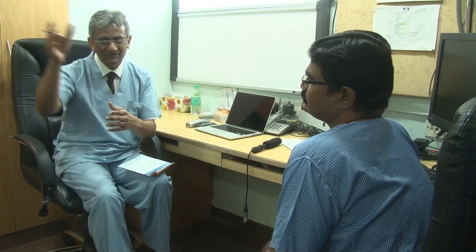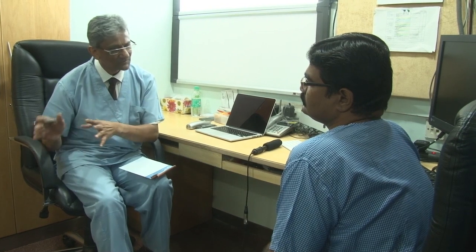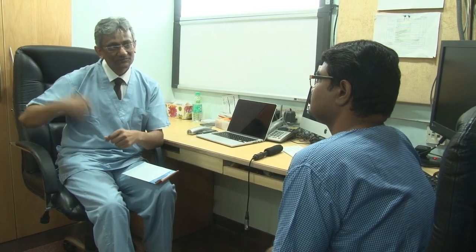So after that air leak, will I have problem in breathing? No. Like I told you before, typically these air leaks are small and they stop within 5 to 10 minutes, and anyway we'll be monitoring and doing scans every hour to check that. Once the air leak has stopped, it will get absorbed on its own. At the most, you'll have a little catch when you take a deep breath. The problem is only when the air leak doesn't stop. If it doesn't stop, then we have to put a tube inside and remove the air. But that also is only the inconvenience of having the tube. There's no other problem that will occur.